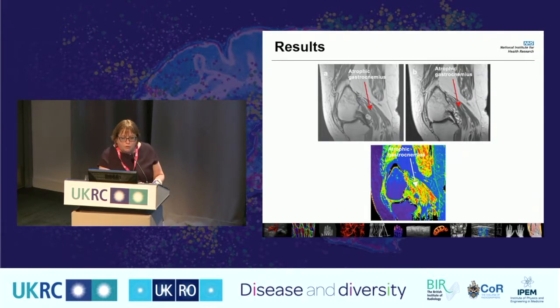We look at somebody that's got a really poor atrophic gastrocnemius, which we can see on these normal conventional imaging up here. Exactly the same happens here, because what happens in the atrophic image is that we get fat infiltration, and we infer fat infiltration when we look at normal MRI. Sometimes we can actually see the strand sitting in here, but with T1 imaging we can actually quantify the fat infiltration because we are imaging fat itself.